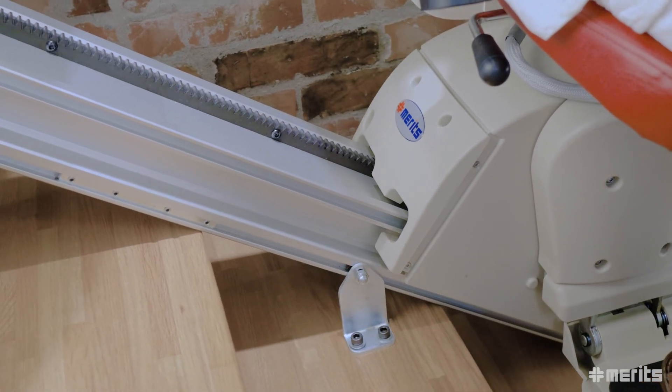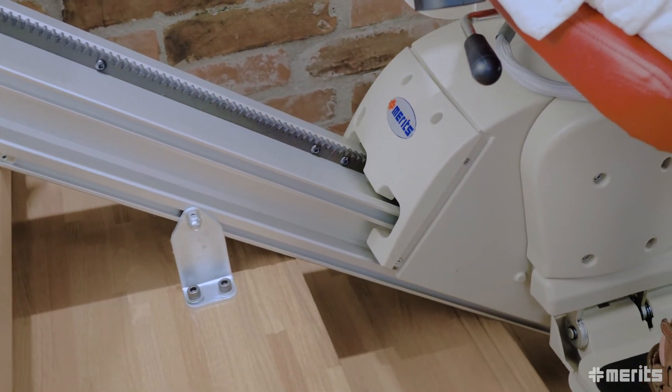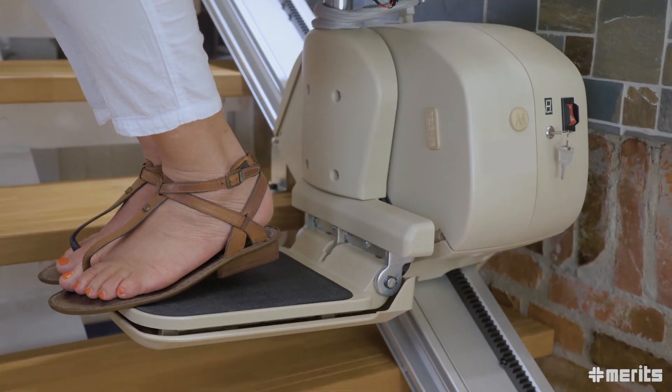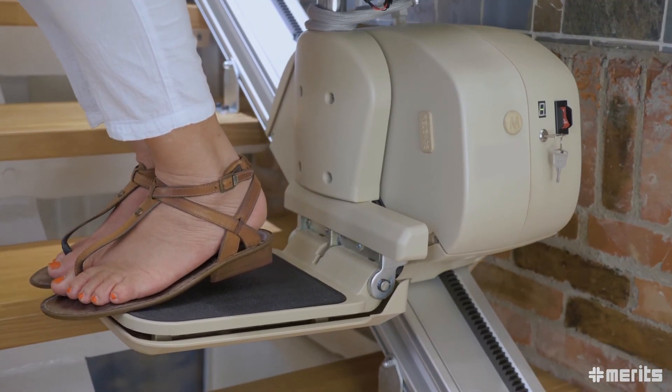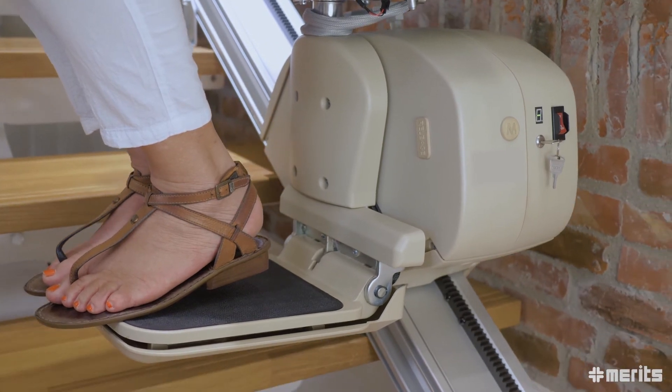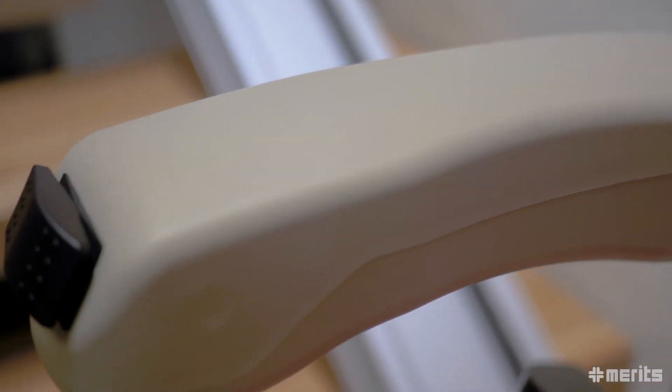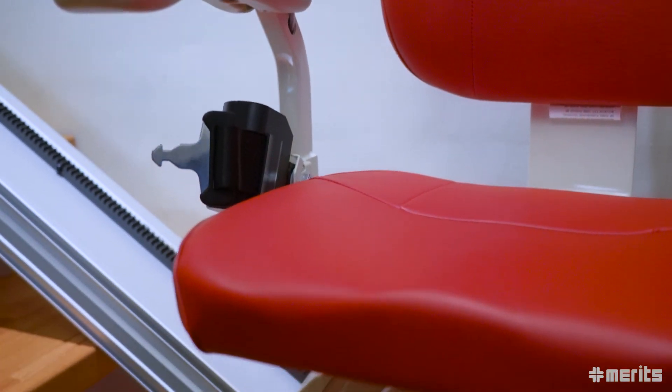The drivetrain has a mechanical braking system which relies on a self-locking worm gear to eliminate the possibility of any uncontrolled movement, giving the rider extra security and peace of mind. Finally, the seat height and armrest width adjusts for the user, improving comfort and safety.